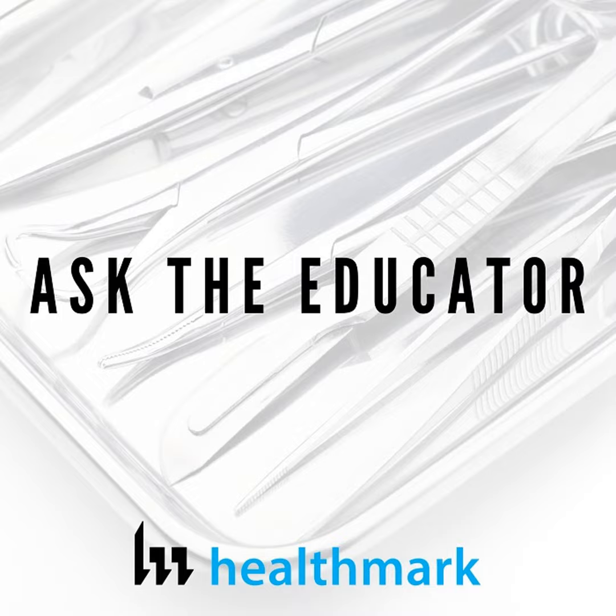It's interesting. One of the puzzling things about ultrasound transducers for me is that when you go into the OR, these questions aren't asked. When you go into the OR, they realize that we don't know what's going to walk through that door. Or in the ER, and therefore they prepare. So they sterilize all the equipment, they prep the equipment. For some reason with ultrasound, there seems to be a different way of thinking, not applying the same standards as you'd see in other areas of the hospital. Spaulding applies to all areas of the hospital. And so knowing what to do is just preparation.